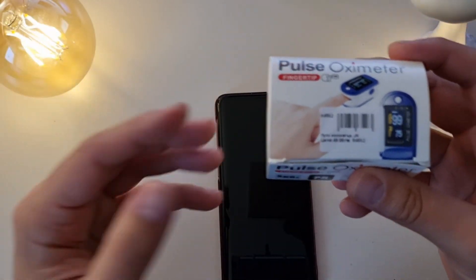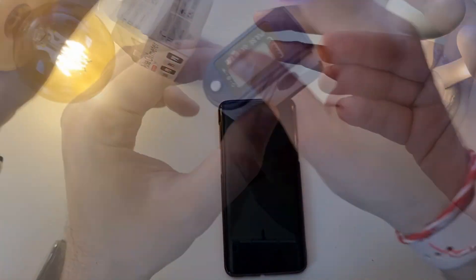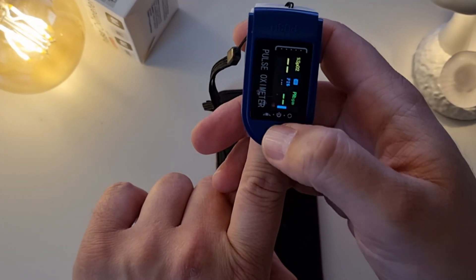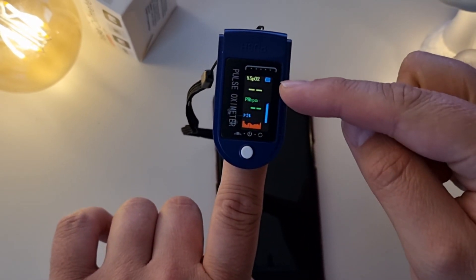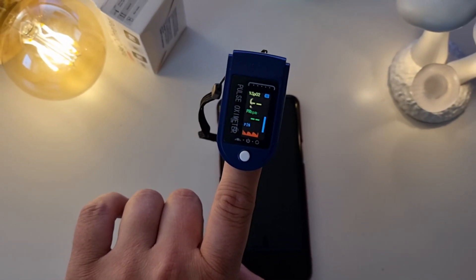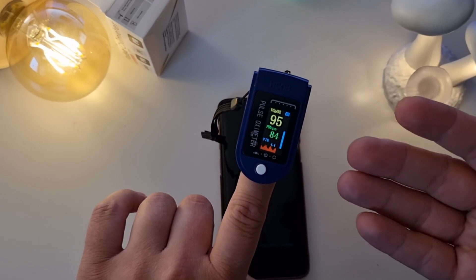Let me show you — it's very easy. You just need to stick your finger in here, then switch it on. You can press once more to orient the display. Now we have the SPO2 measurement and also the pulse rate in beats per minute. Let's wait a bit — 94. Using a pulse oximeter is very simple: place it on the finger and you get your reading.